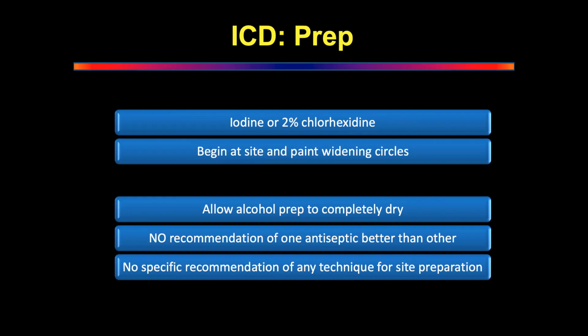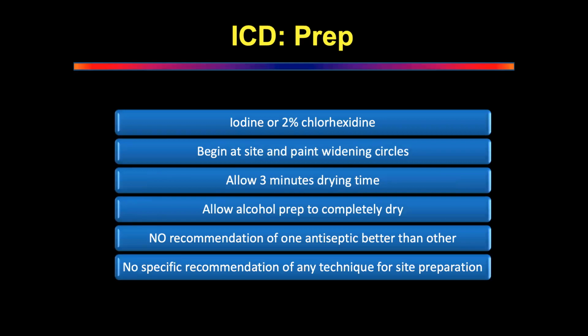What else? And then you drape the patient, sir. Before you drape the patient, what should you do? Mark the site. Wait for it to dry. Otherwise, your drape will not stick. All right. So it's very important to wait for it to dry.